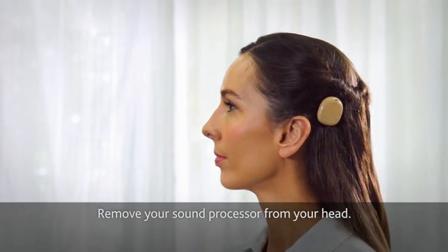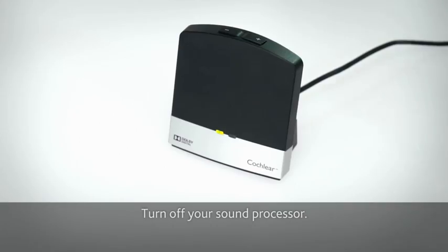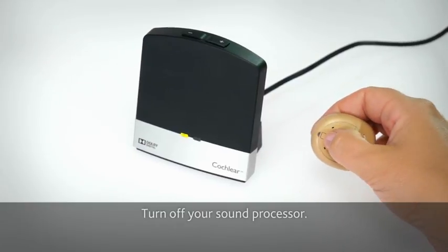Remove your sound processor from your head. Turn off your sound processor.